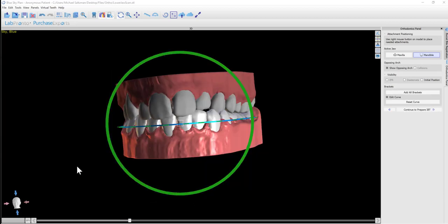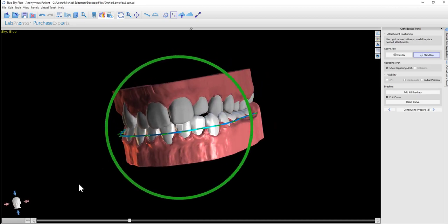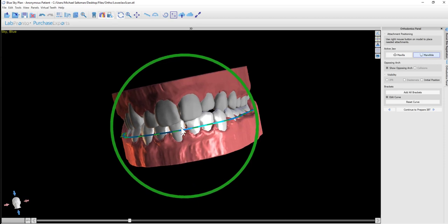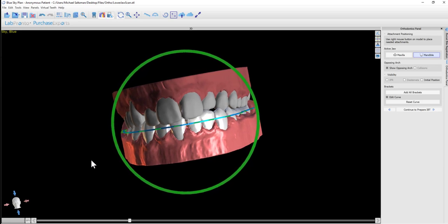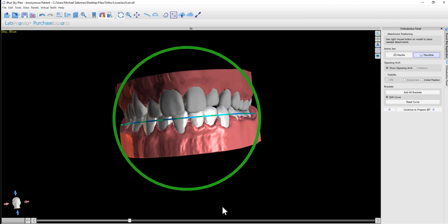The software now shows a curve representing the location of where the brackets are going to be added. We have maxilla and mandible draw options — right now we're on mandible and we have the curve. The curve can be raised higher or lower by grabbing the square in the middle with the left mouse button, and rotated from side to side using the large rotation circle.